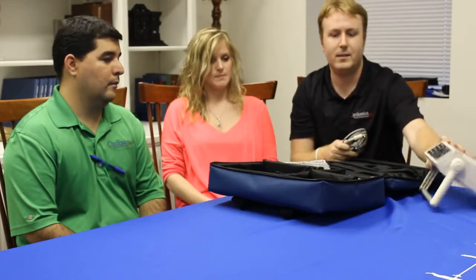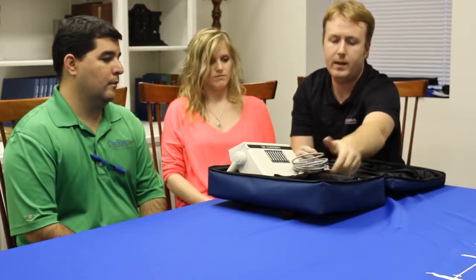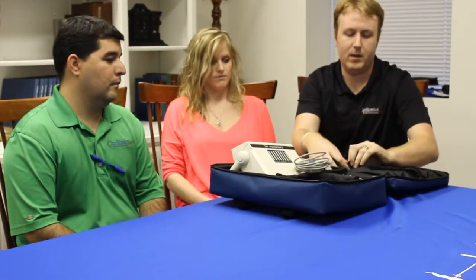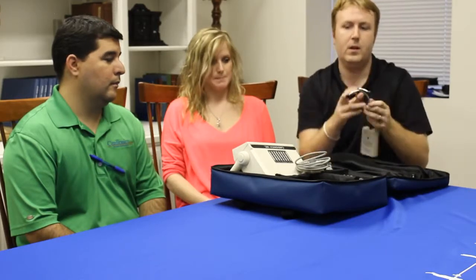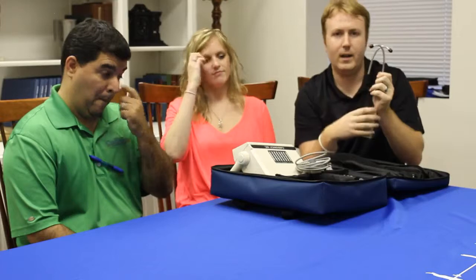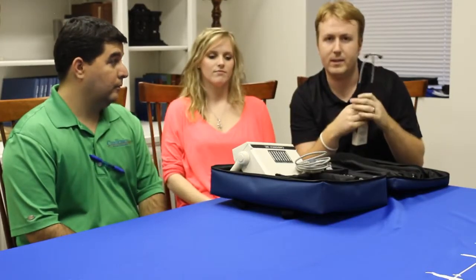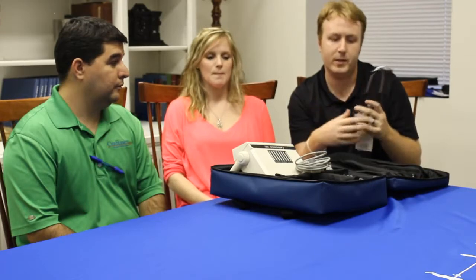What we've got is a box that comes within the system. We've got a stethoscope head and these Hartman infrared headphones. They receive an infrared signal out of the box that allows up to 20 people to simultaneously listen to heart, breath, and bowel sounds of a live patient.